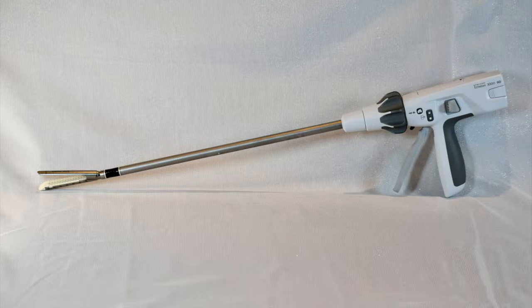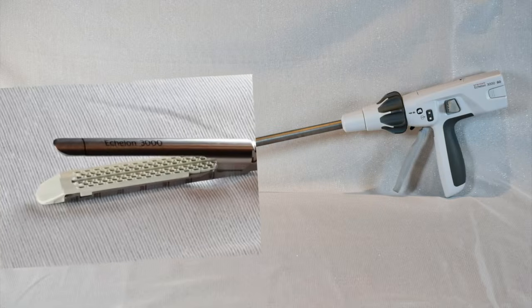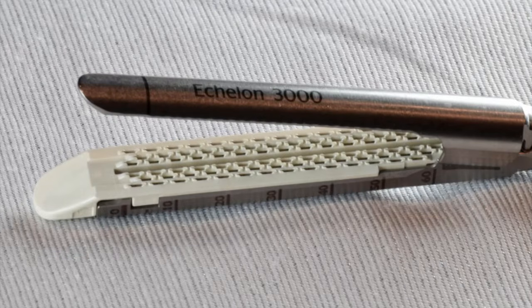So now let's take a close-up look at this stapler so you can see it in action. You're going to be blown away by how this thing functions. It's really cool. So here's a close-up of the head of the stapler. These tiny holes here are where the staples come out and seal the tissue. There are 6 rows of them.